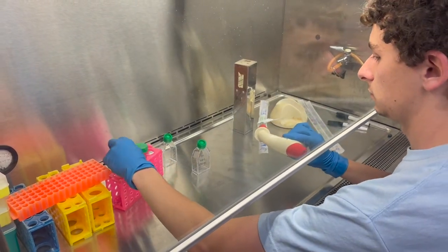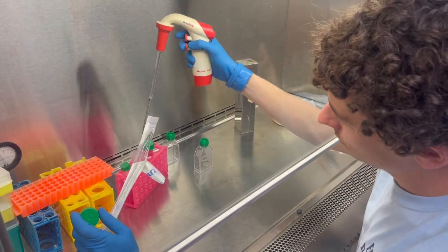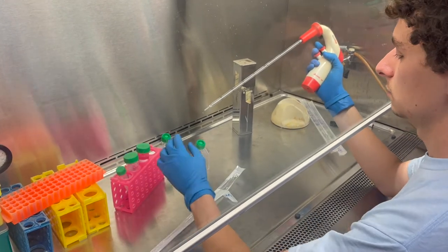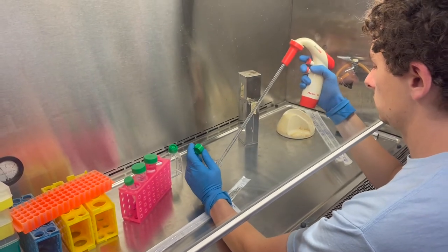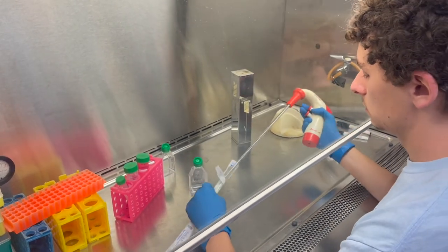Pipette PBS onto the cells to wash off excess media using a plastic pipette. Dispense the liquid away from the cells and then carefully tilt the flask on its back so the PBS covers the cells and rock gently. Use 5 milliliters for a T25 flask or 10 milliliters for a T75 flask.